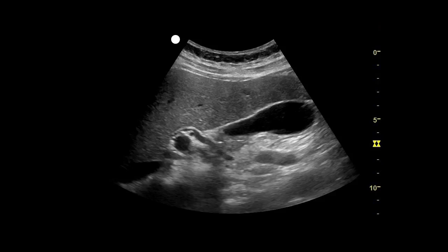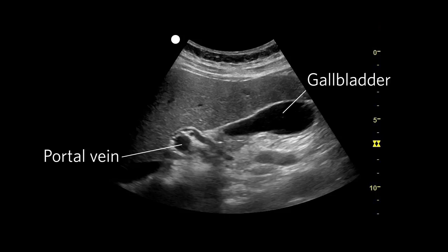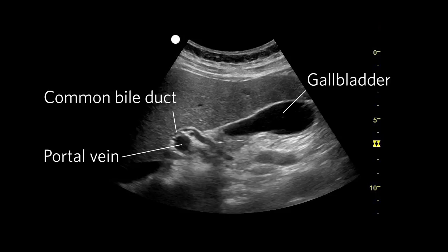Point-of-care ultrasound of the gallbladder can detect gallstones and signs of acute cholecystitis. Here's an example of the image we hope to generate with this scan. In the image, you can see the gallbladder, portal vein, and common bile duct.